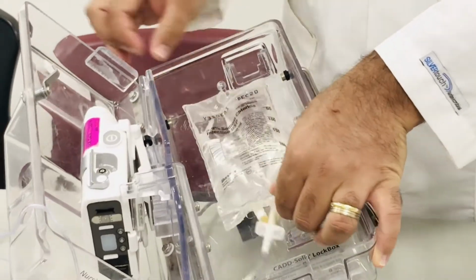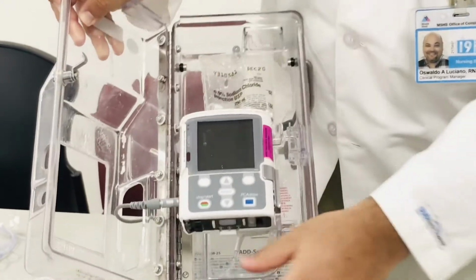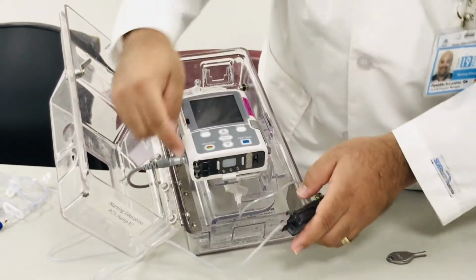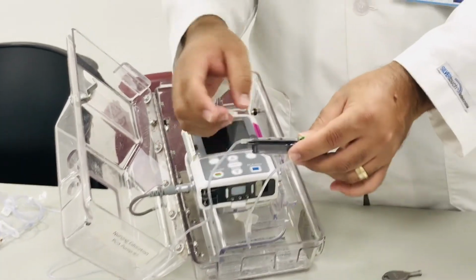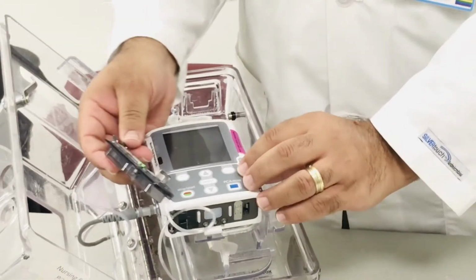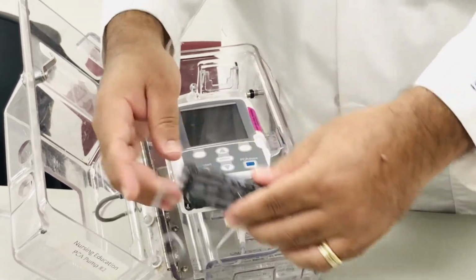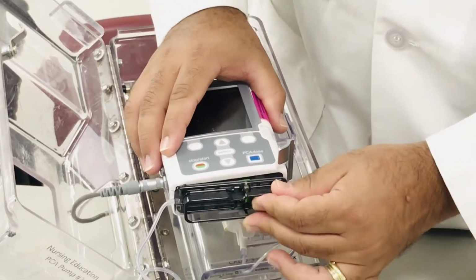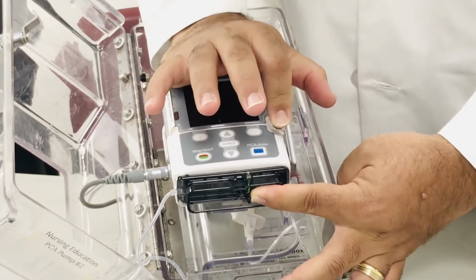Once you hang your pain medication, the next most important thing to do is to ensure that the tubing is not kinked, and there are a set of hinges under the machine and a hook on the cassette. What you want to do is unlock the cassette. This locks the cassette in place, and you are going to, in those hinges, put the cassette. Once you press, you're going to close the lock.